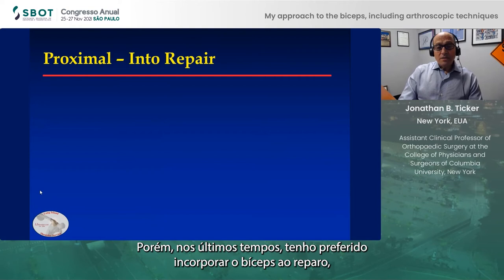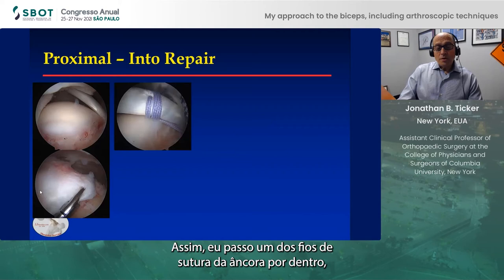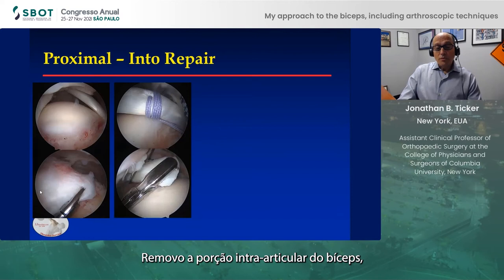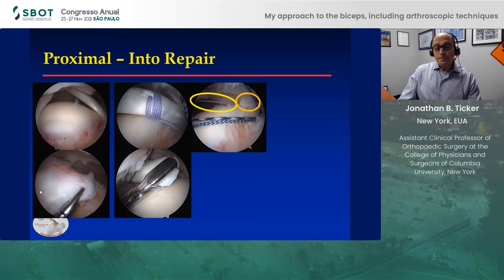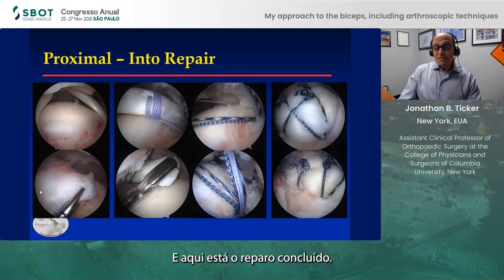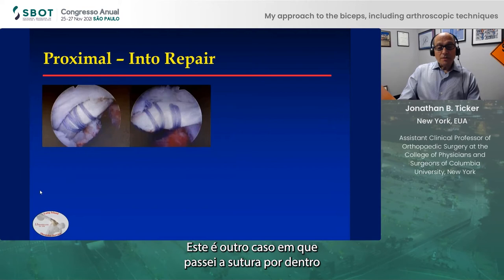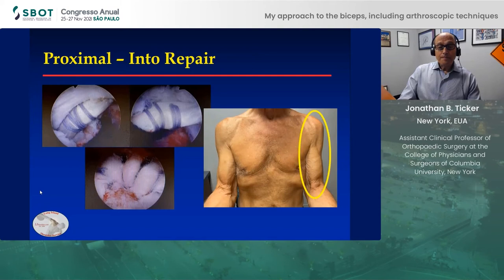More recently, I favor incorporating the biceps into the repair, which I picked up from Butch Krishnan a number of years ago. This is a right shoulder where I'm not able to fully reduce the posterior superior tear, so the biceps will be exposed. I pass one of the anchor sutures through, around, and through the biceps tendon and then through the overlying soft tissue. I'll remove the intraarticular portion of the biceps and continue passing sutures through the cuff. Additional anchors are placed, and this is the completed repair — here is the suture that incorporates the biceps. Here's another case where I've incorporated the biceps a number of times into the repair, and this is the patient who just came in last week with a good outcome.